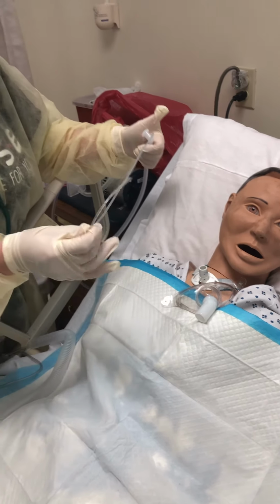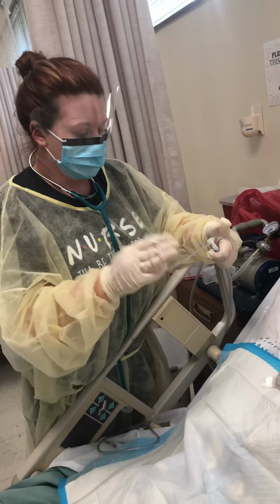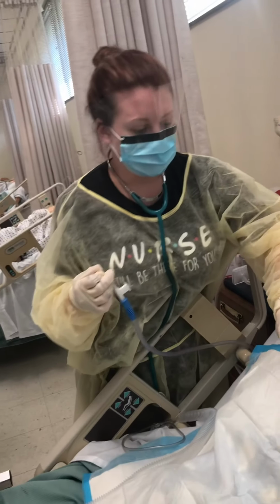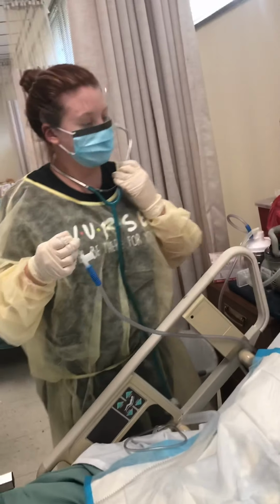And he has got some clear secretions coming out. Now I'm going to apply his oxygen source back, and I'm going to listen to his lung sounds again.